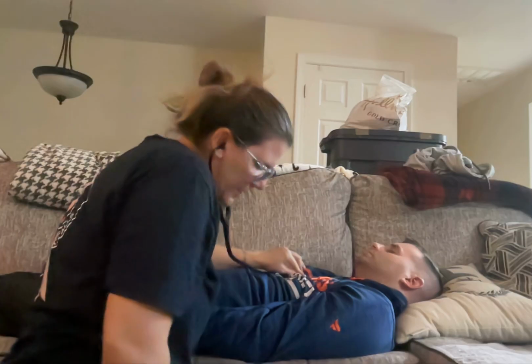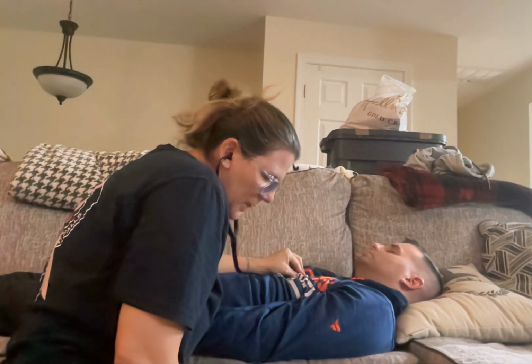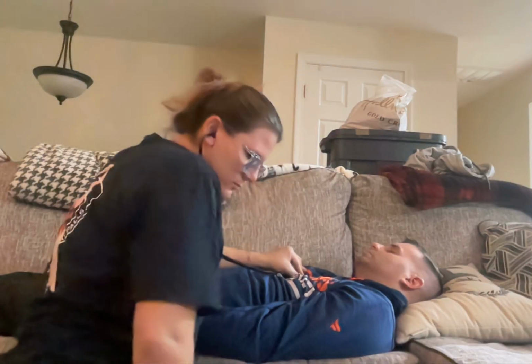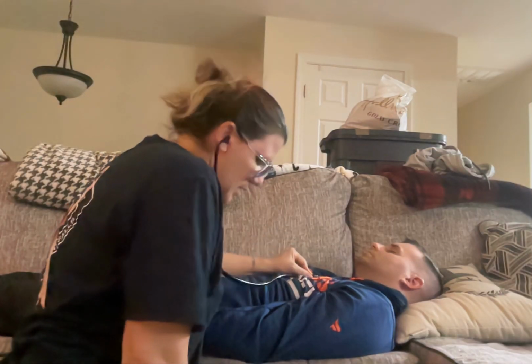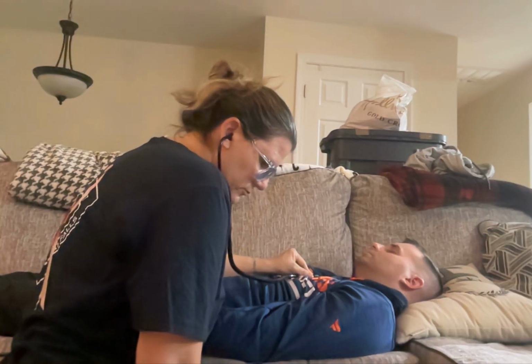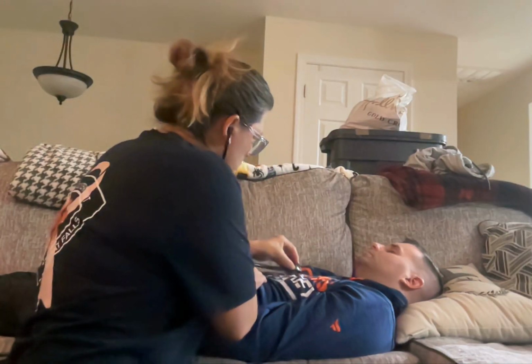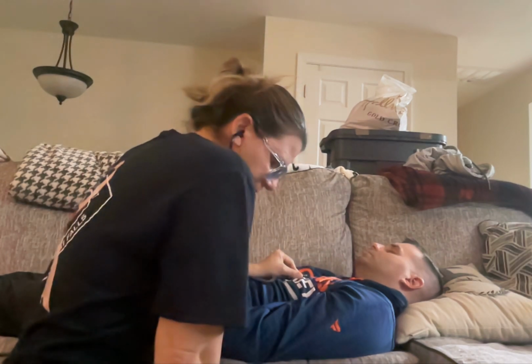All right, so starting at the right sternal border for the aortic valve. And then I'm going to come over to the left sternal border, and now I'm listening to the pulmonic valve. And I will come down 1 to Erb's point.